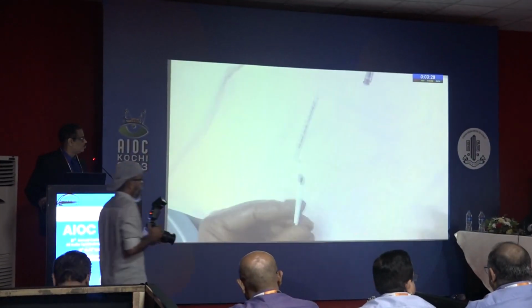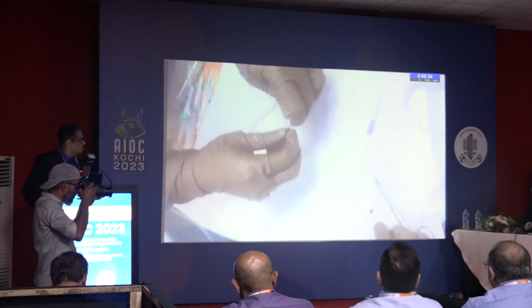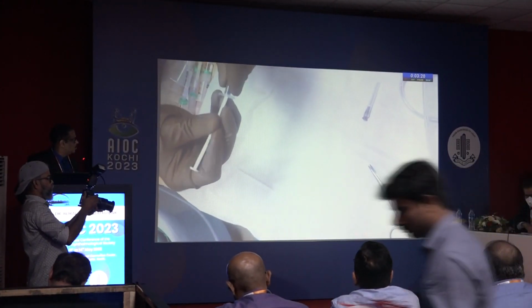We have removed the plunger and cut the rubber cap of the plunger of a 1 ml syringe. This cut rubber cap was fitted inside an empty 1 ml tuberculin syringe.